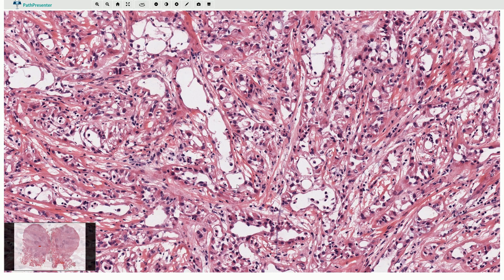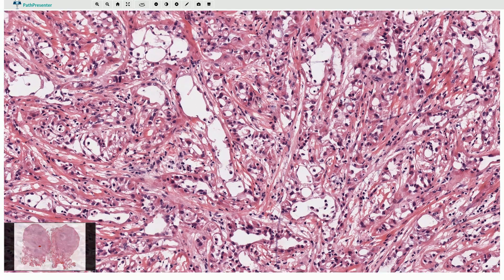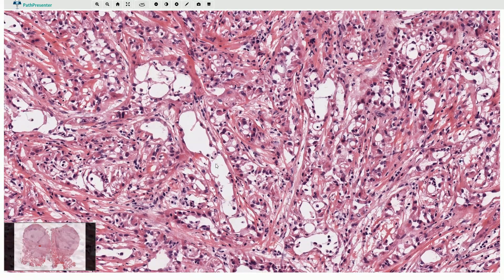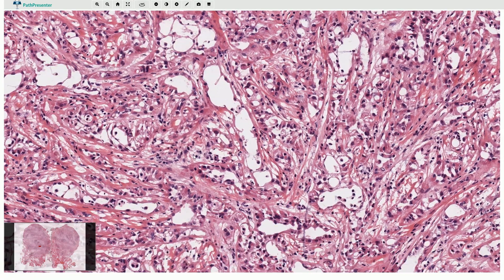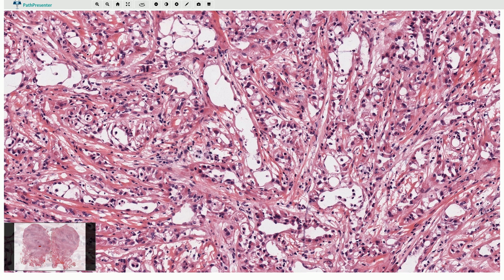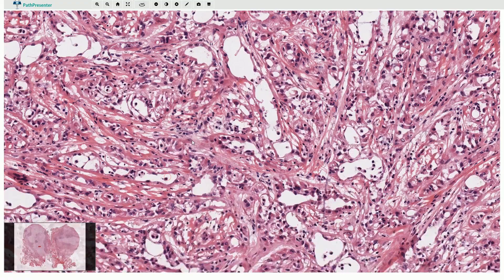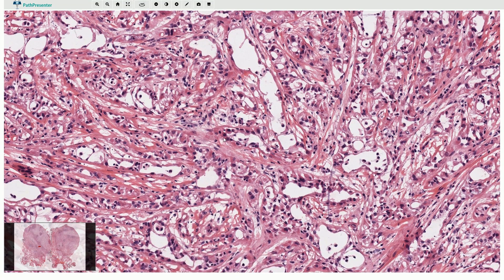Here we can see also gland-like spaces lined by cuboidal cells, and some of these mesothelial cells have an epithelioid appearance. The nuclei of these cells are bland, round or oval shaped. Nucleoli are not prominent. There are no mitotic figures, no atypia, no atypical mitotic figures, and in between the cells we commonly see chronic inflammation composed of lymphocytes, as we can see here.